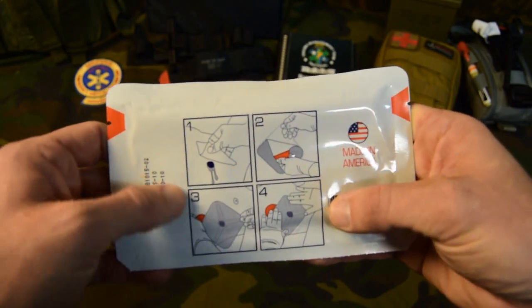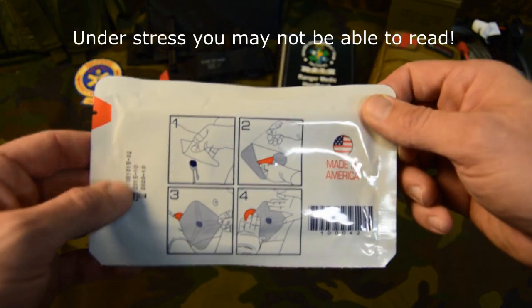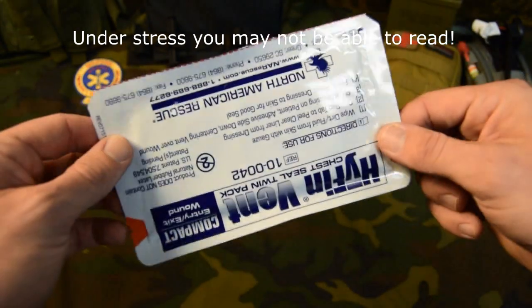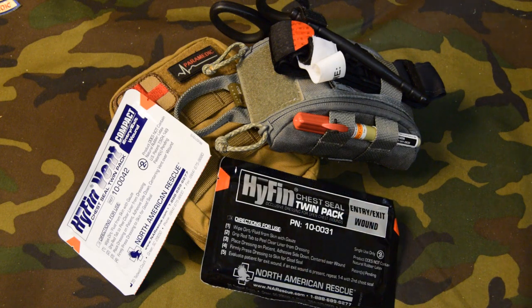Also has a nice drawing in case you can't read. You pull the red tab, pull the red tab, slap it on the chest, and you hopefully will seal the chest. The difference between a vented chest seal and a non-vented chest seal is going to be personal preference more than likely. The vented chest seals are supposed to prevent your patient from building up a tension pneumothorax, which puts pressure on the heart and causes them to go into shock. So if you're using the vented, it's supposed to vent the blood and vent the air. If you're using the non-vented, you may have to actually pull it back and release some of the pressure if your patient starts becoming shorter of breath.